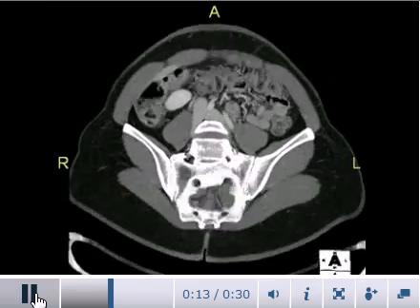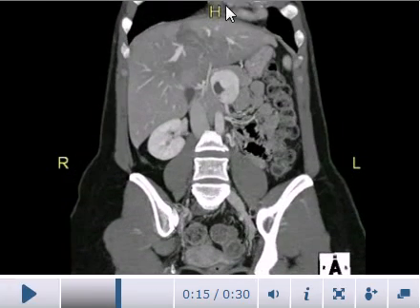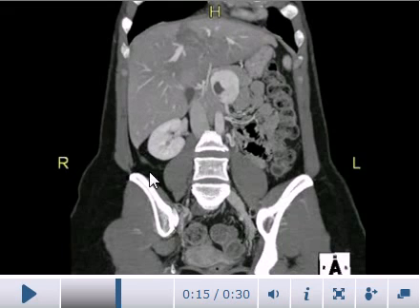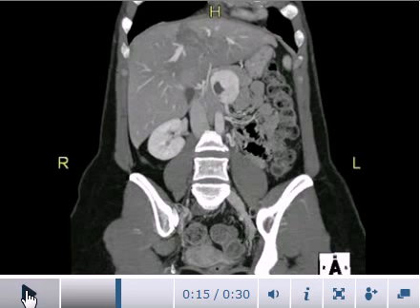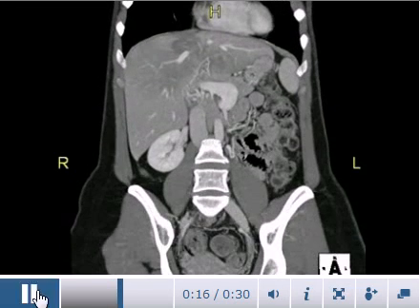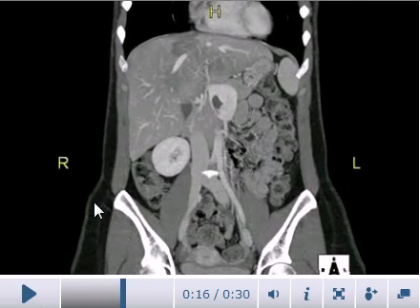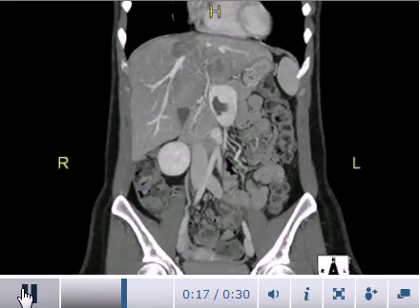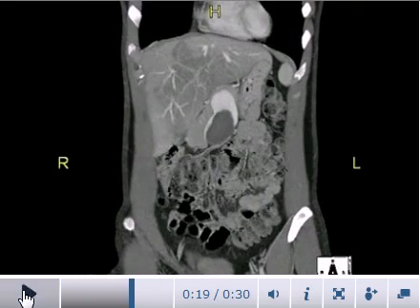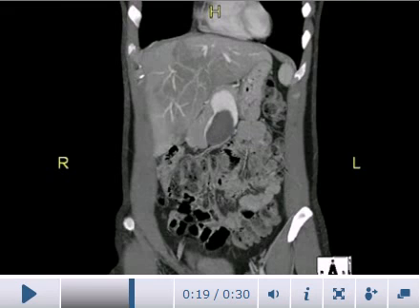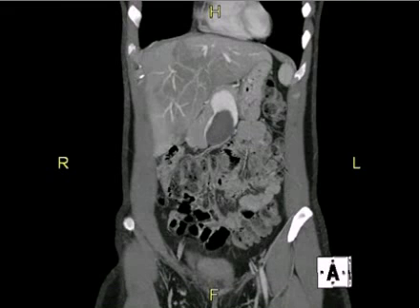Now we move to the coronal reconstructions. This is the right hemidiaphragm and the left hemidiaphragm, with the liver below. The right kidney, which is pushed down, is now clearly visible. This is the blood clot in the superior mesenteric vein, which collects blood from the intestines and takes it to the liver. The heart is visible here as well. Thank you very much.